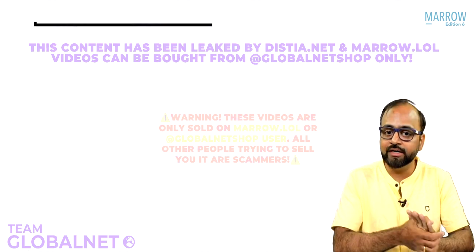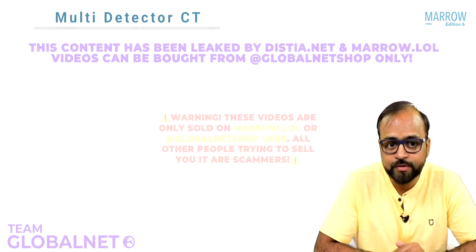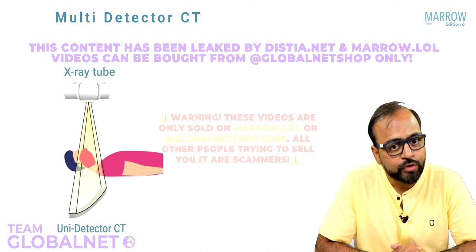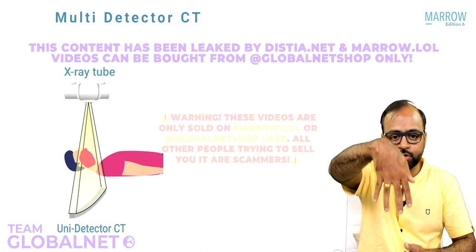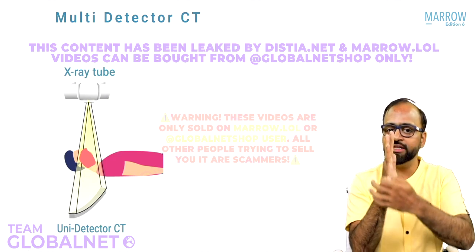One more advancement about CT scan I want you to know, and that is what is called multi-detector CT. What is the most important difference between a routine CT and multi-detector CT? See here, a routine CT equipment usually, I said, uses a fan-shaped X-ray beam. If you look at a fan-shaped X-ray beam, it looks like this from the front, but from the sides it is very thin. So look at the image here.